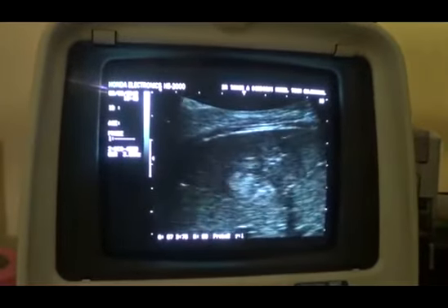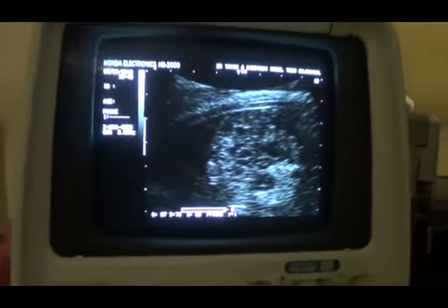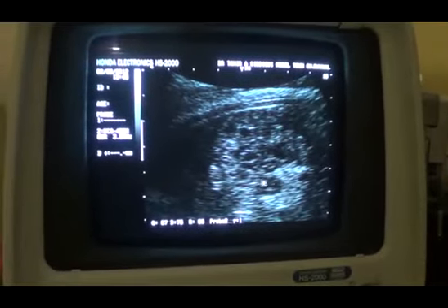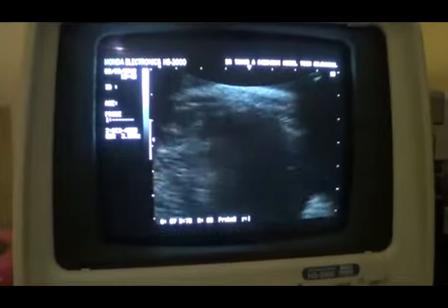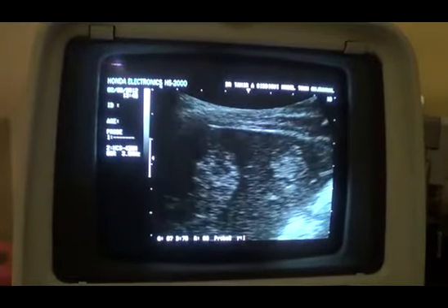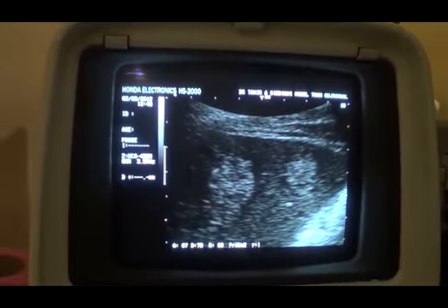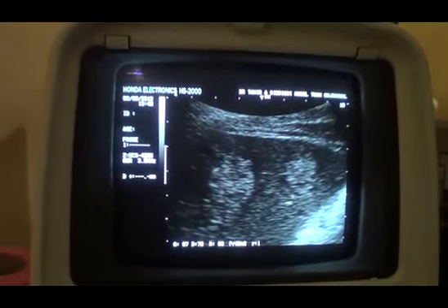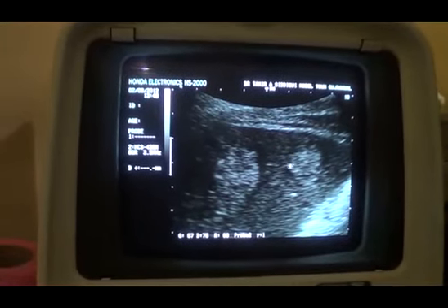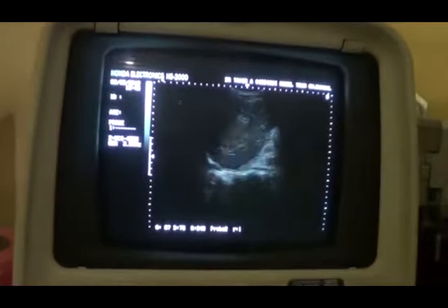See the outer surface. The liver echogenicity has gone down. Yes, that is the one issue. Then there is a solid focal mass lesion with internal cystic areas in the anterior segment of the right lobe. Along with it, we see a satellite lesion of the same configuration as the lateral lesion. This is the medial one, having the same configuration, echogenic, no posterior shadowing, halo around, and tiny cystic areas within it. So there are two in this section.